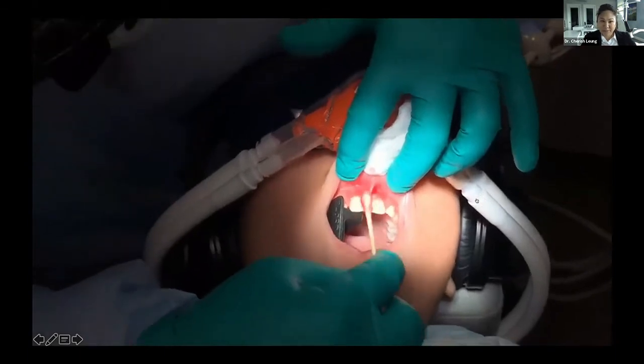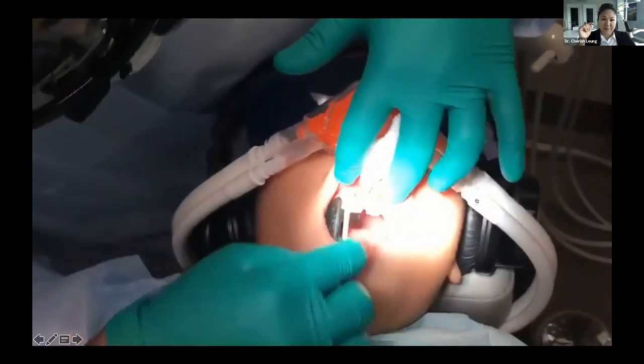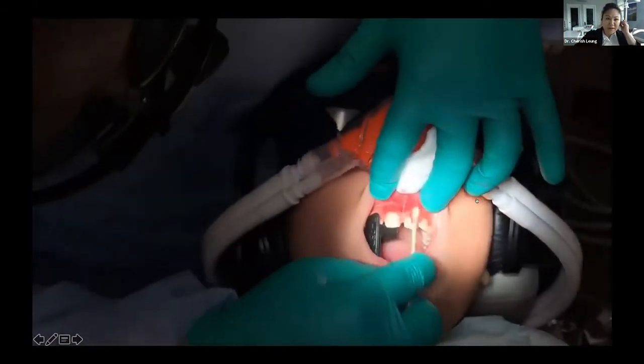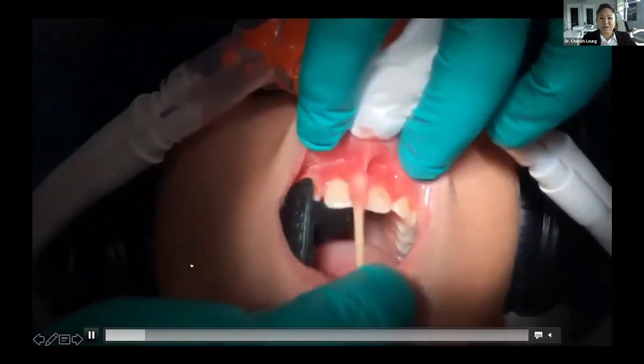So this is just an example of how we do the procedure. Again, easy to see. We still use a bite block in our older ones because it allows you to suction really well and not have to worry. You can do it a lot quicker. So I applied lots of topical on this kiddo.